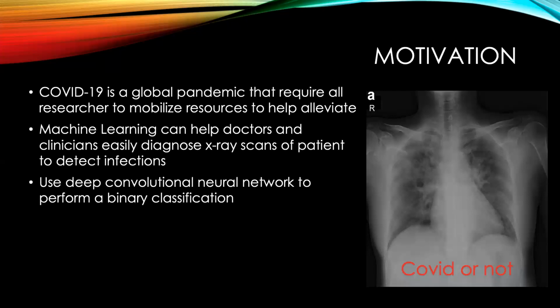As a matter of fact, the classifications and the labels are with respect to either it's a normal lung image or it's a pneumonia. But if it's a pneumonia, we do not know whether it's a result of COVID, a bacteria, or a virus other than COVID-19.